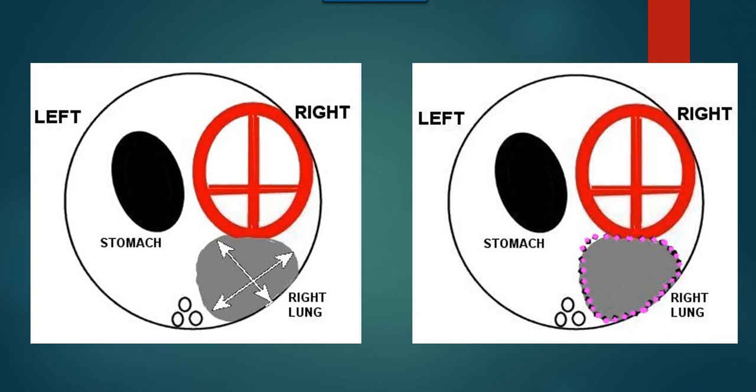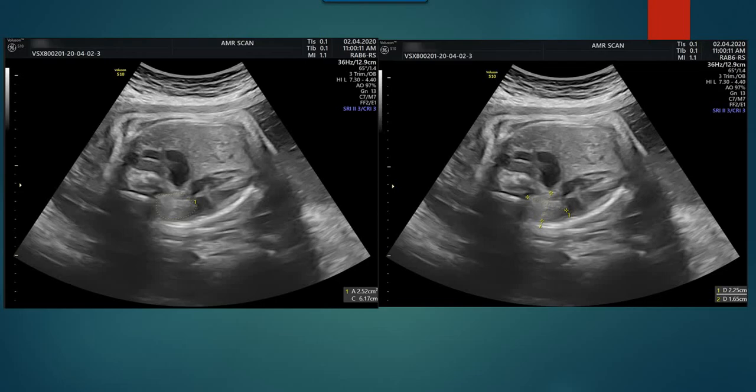Here on ultrasound, we will diagnose it by the lung to head ratio, which can either be by the diameter method, which is less accurate than the area trace method. This is done for the lung contralateral to the diaphragmatic defect, and is better when this lung is close to the transducer. Here is an example in our case of how to measure the diameter and area methods in order to get the lung to head ratio and observed to expected lung to head ratio.